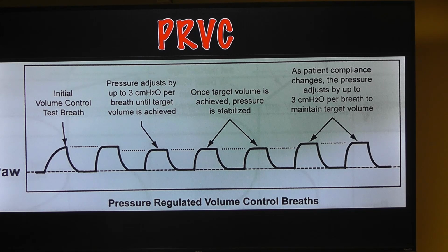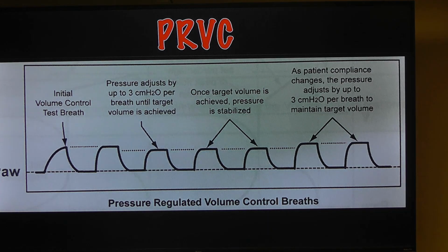This is what the T1 does, okay? The T1 and the C1 cannot do a true volume breath. It does a PRVC mode. What is referred to as volume on here is actually PRVC, and then it does true pressure control, okay? Which is the reason we have the LTV.